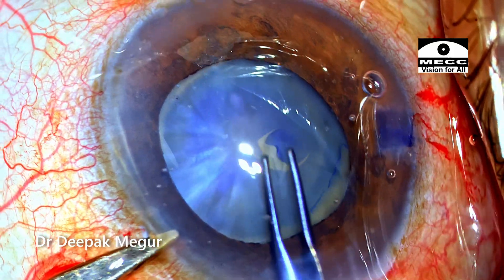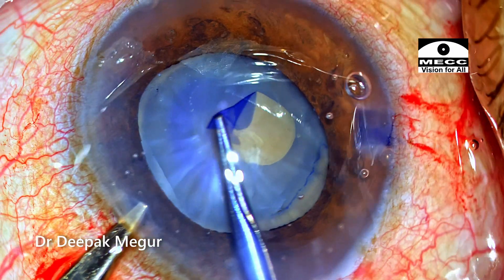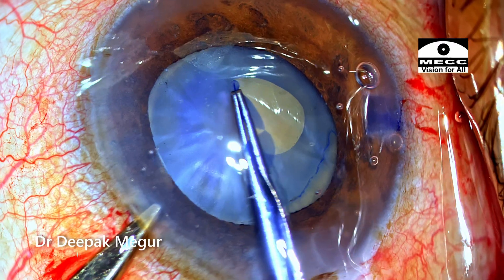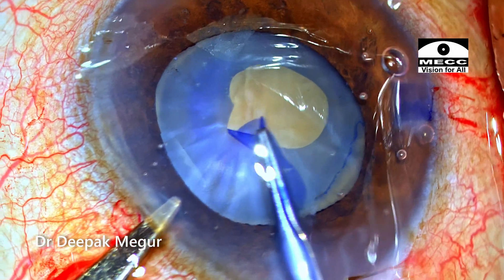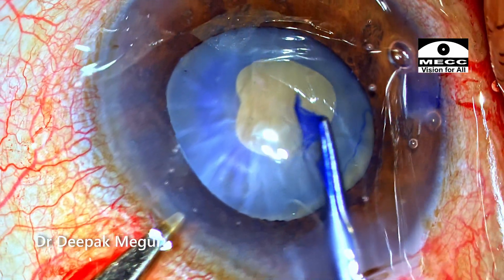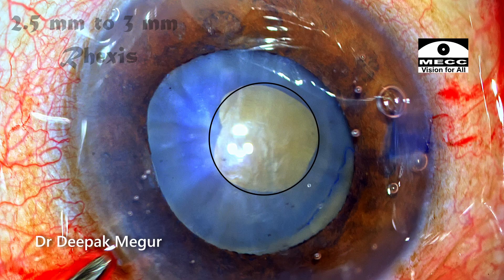The anterior capsule is very tense because the lens is very swollen, and there is every risk of the rhexis running away to the periphery. I aim to make a very small rhexis. I can feel that the capsule is very tense, so I am using only the tearing technique, keeping the flap flat and pulling centripetally. The rhexis is about two and a half to three millimeters, and before enlarging it, I need to decompress the bag.